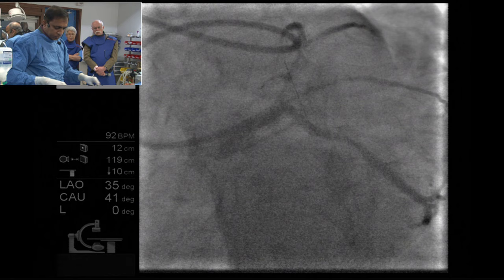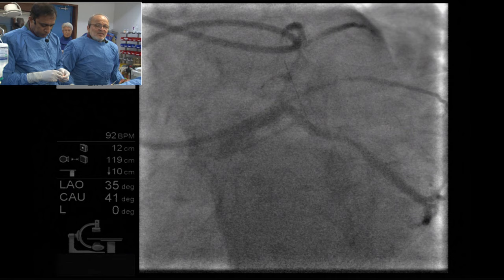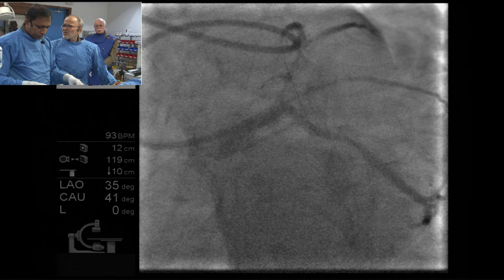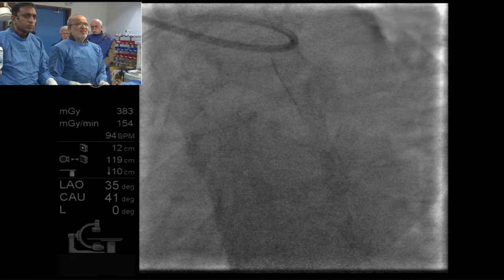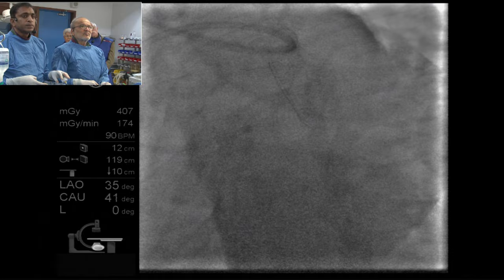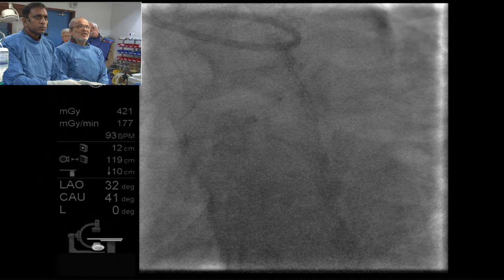Teachers, do we know what the initial stent was that was in there? Do we know what the original stent was that was placed in this LAD? It was before 6 months. Right. And I think the stent was Xience. Xience, okay. So are you going to use a different drug? I think so. I will be using Orsiro, that is sirolimus. Last year you also showed one case of this arteria lusoria PCI. Somehow they come to our lab.